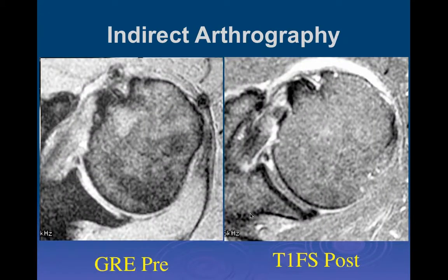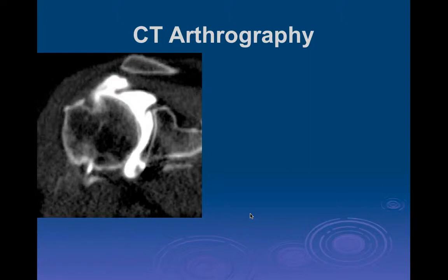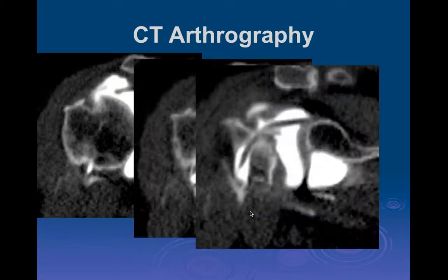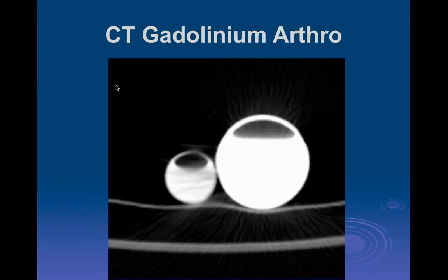If somebody does have problems, you can do CT arthrography looking at the shoulder, but you're all aware of that. This just shows contrast going into the subacromial subdeltoid bursa on CT. One thing that occasionally we see are individuals who can't have an MR because they have a pacemaker or something, and can't have a CT arthrogram because they've got a documented sensitivity reaction to iodinated contrast material. It's not an allergy, so please don't call it an allergy. It's not an IgE-mediated response.